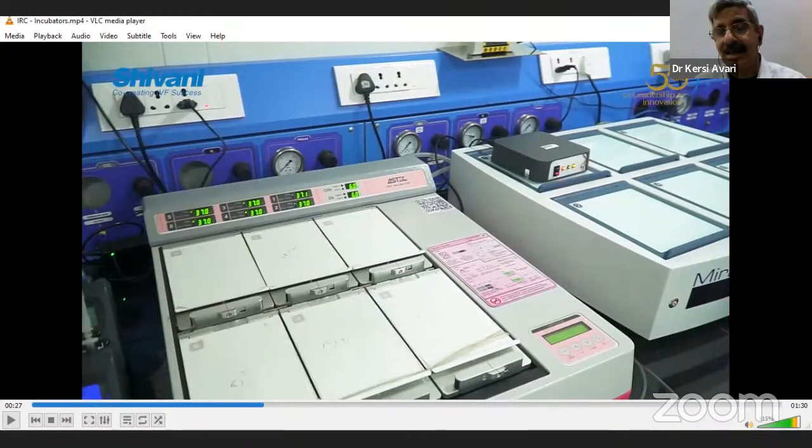If the AC suddenly gets shut off, the ambient atmosphere becomes warm, immediately the warning starts, temperature less. Now let's take a nasty example, that at midnight you are not in the lab, light goes off for 2 hours. The incubators will keep on blinking and sending their alarms, but there is nobody to listen. Power comes back after 2 hours, they start functioning normally.